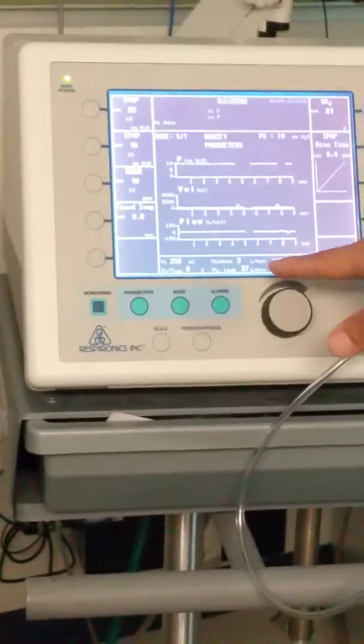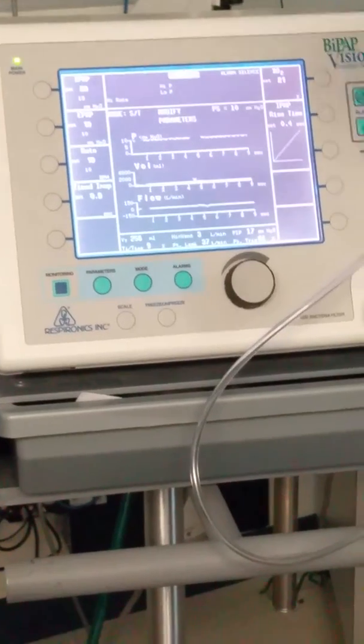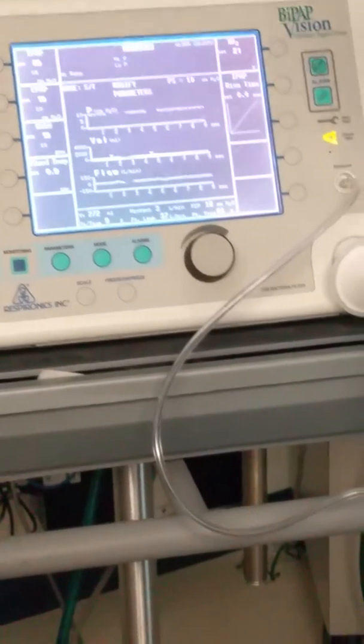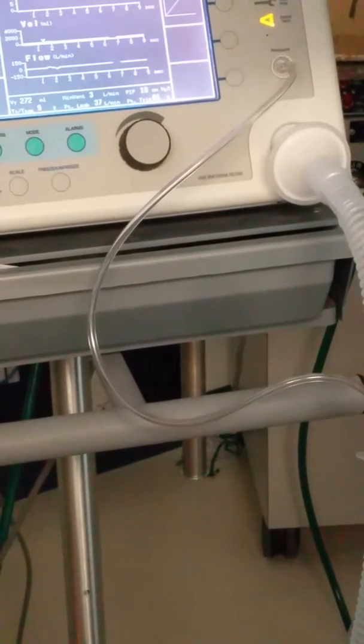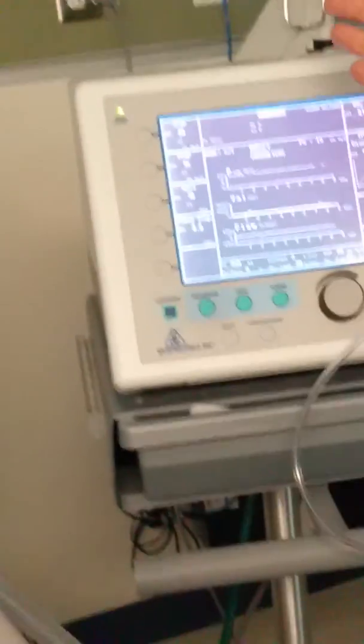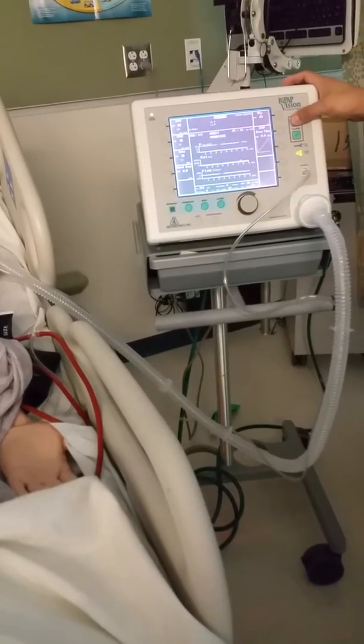So we have a leak of 37 on him. Ideally, we really don't want to be over 25 because, again, you can see, you can hear the flow is more now because he has the bigger leak. So if I can close that leak, it will actually improve a little bit.